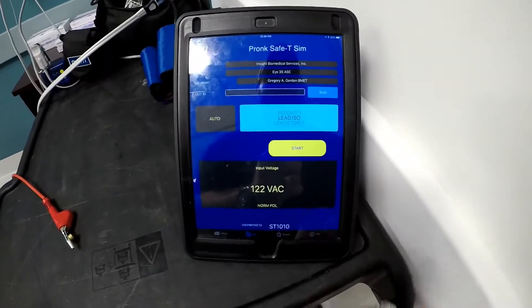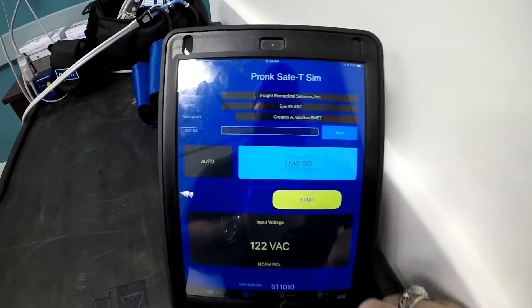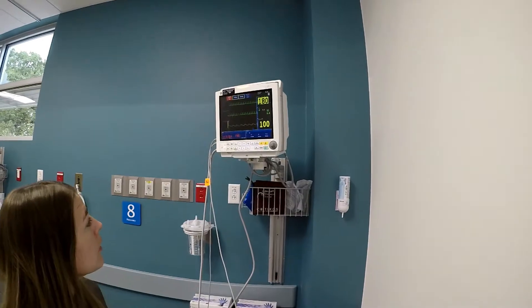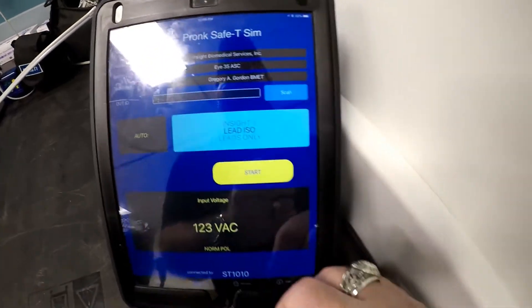You simply select a test — a preset, or one that you can edit. In this case, we're doing a GE Vital Signs Monitor, and while Madison hooks everything up, I will select the lead isolation test.